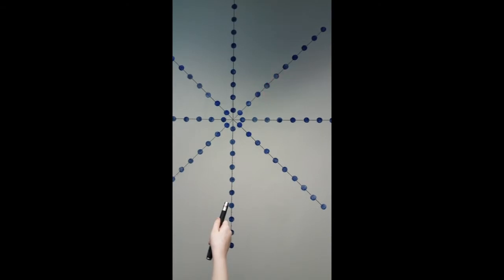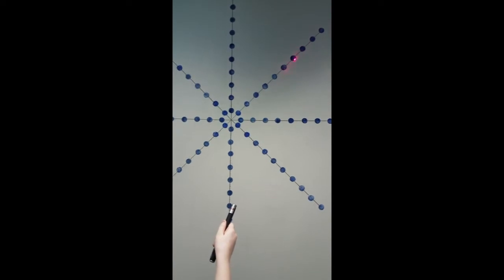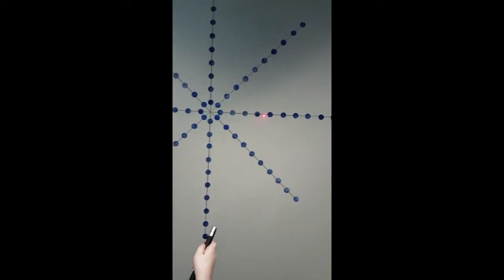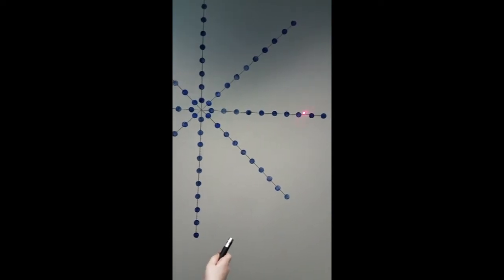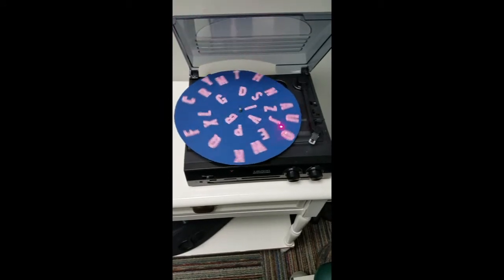Here we have a simulated light board, and we're using a laser pointer to jump from wormhole to wormhole, otherwise known as dot to dot, working on visual motor integration. We then tried to weave the laser pointer in between the dots without hitting the circles. Again, working on pursuits and saccades. Here we're also working on pursuits.